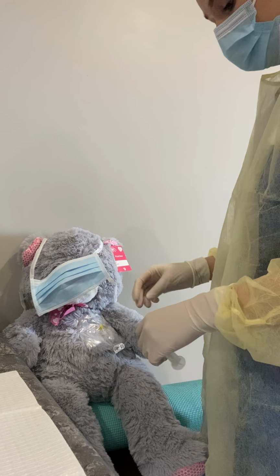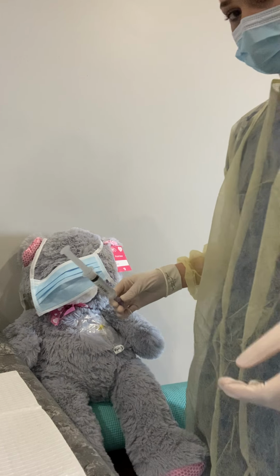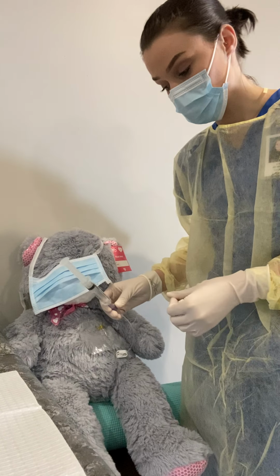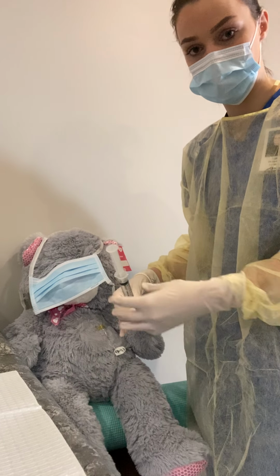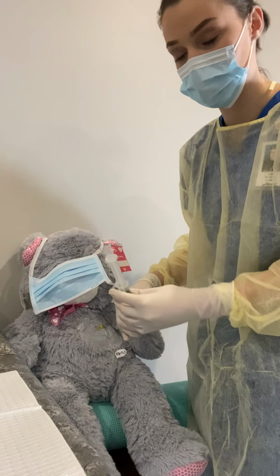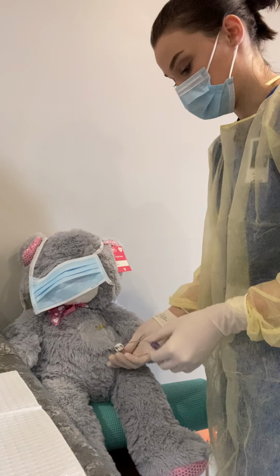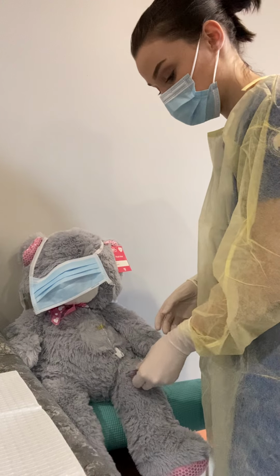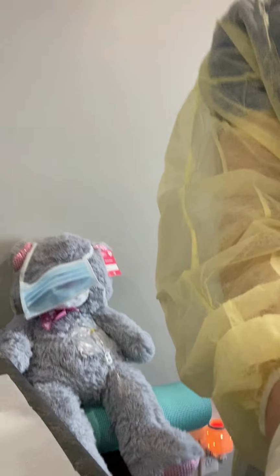And then I can leave this connected and I can initiate the IV fluids that the physician ordered. So I can connect that, or if we just needed it to be placed for sometime today, something's happening, I can disconnect this and then I'll clamp and she's good to go. So she's got her port all there.